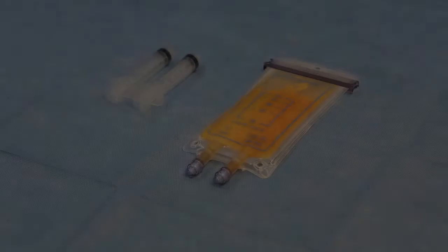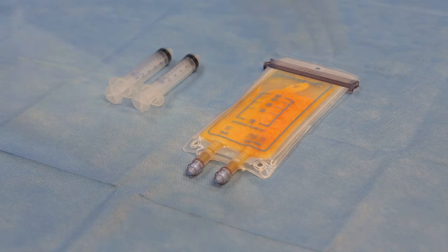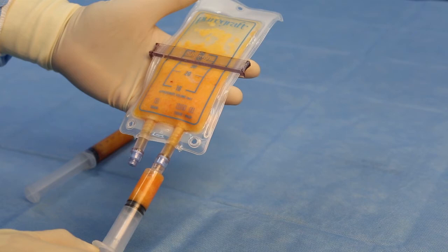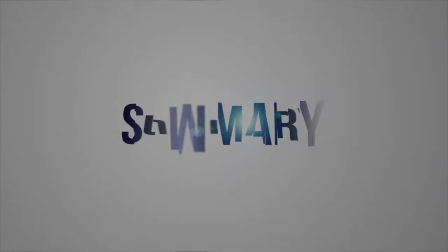Before extracting graft, first move the slider down to collect all the graft towards the ports. Then attach an empty Luer-lock syringe to the tissue wash port and extract the desired amount of graft into the syringe. Attach the preferred injection cannula to the filled syringe.